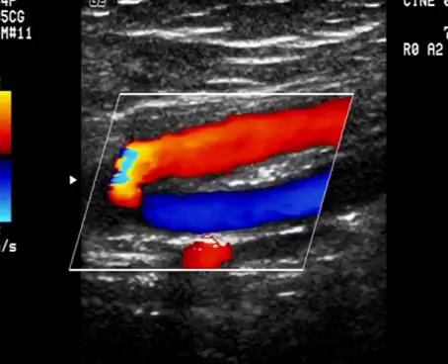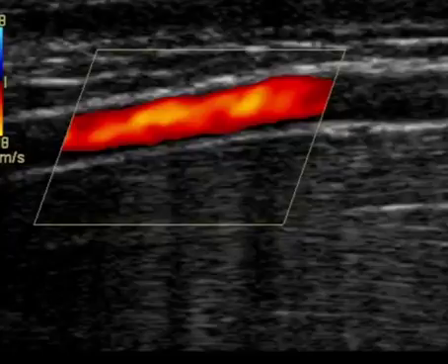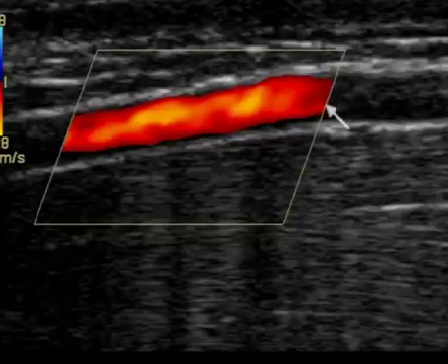So here we see no evidence of plaque or disease at this level. However, these vessels are being kept open because of this collateral supply. Here's another color image of a normal vessel, and again, we can appreciate, where we don't see the color, the thin wall here, nice smooth wall, and good color filling right out to the edges of the wall.